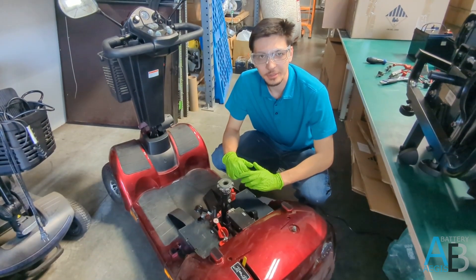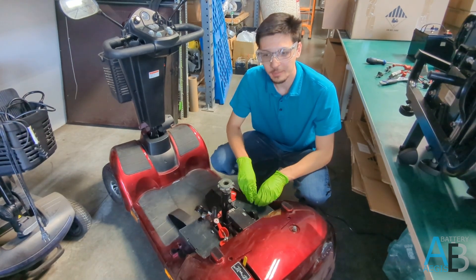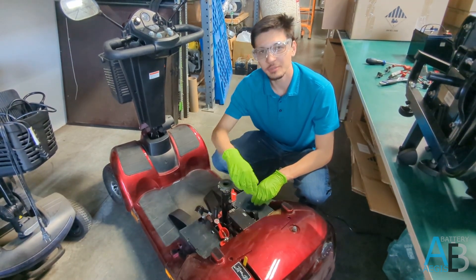If your mobility scooter has two batteries like this model, I would recommend that you install each battery one at a time to avoid confusion when installing the cabling.